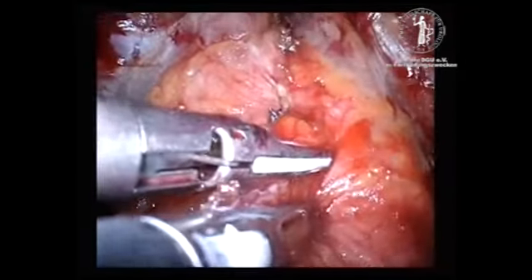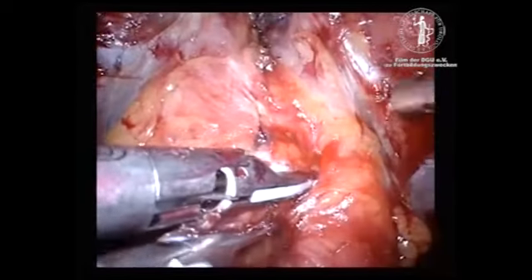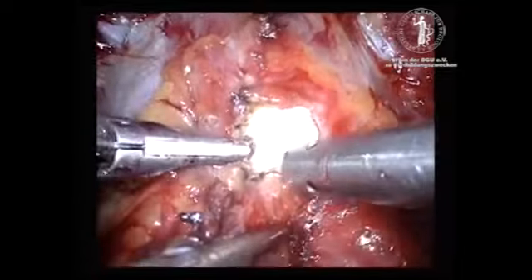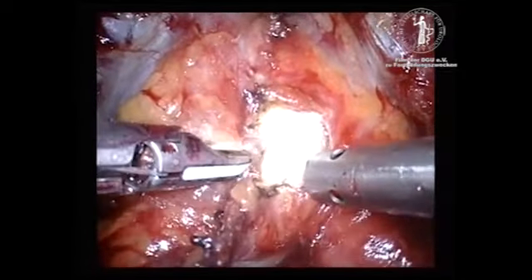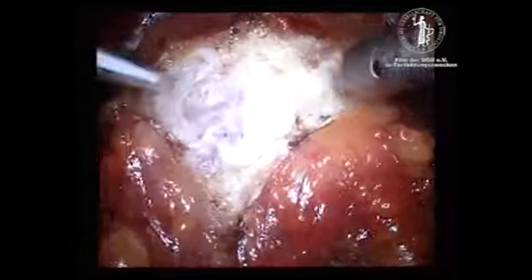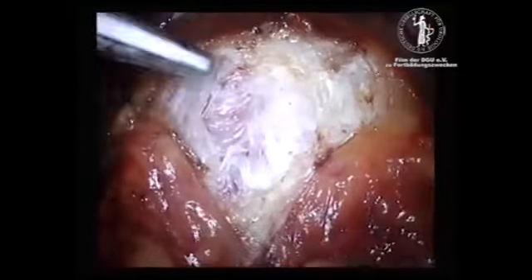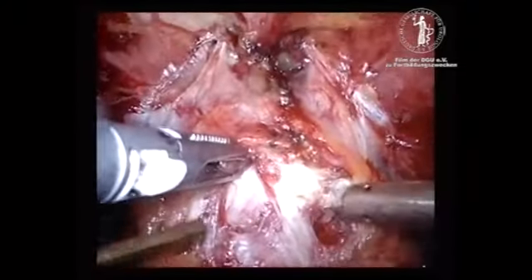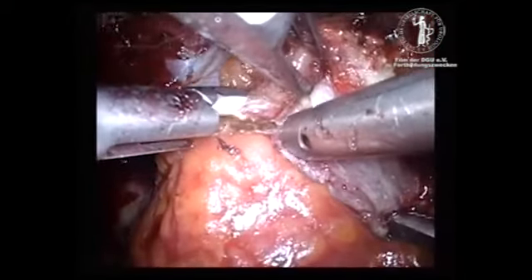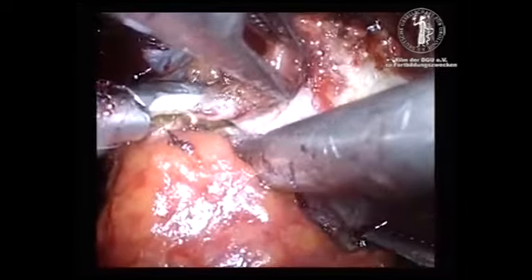The superficial branch of the deep dorsal vein complex is fulgurated with bipolar forceps and divided. A sharp incision of the superficial fascia overlaying the prostate is performed as shown in the video. The main goal is to create the landmarks where further dissection will be performed later during the procedure. The incision is performed on the left side from the bladder neck toward the apex.